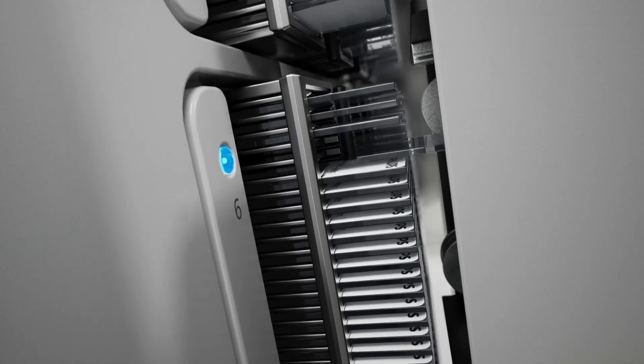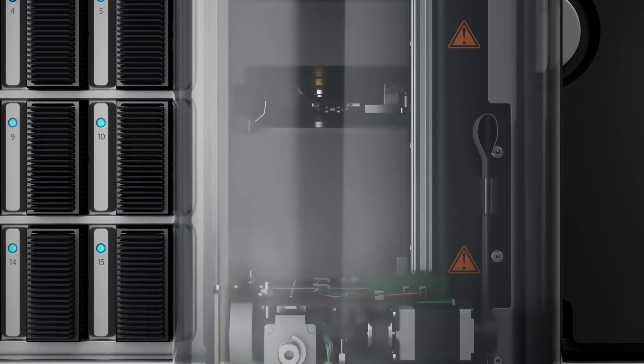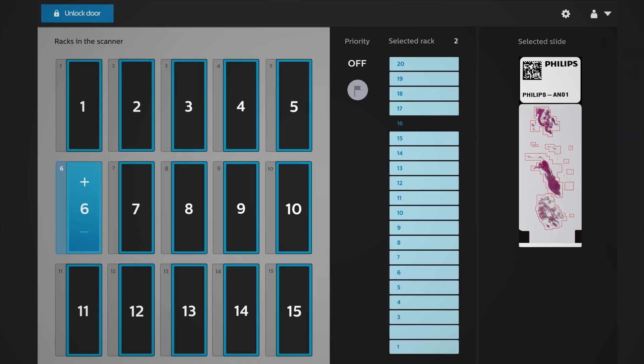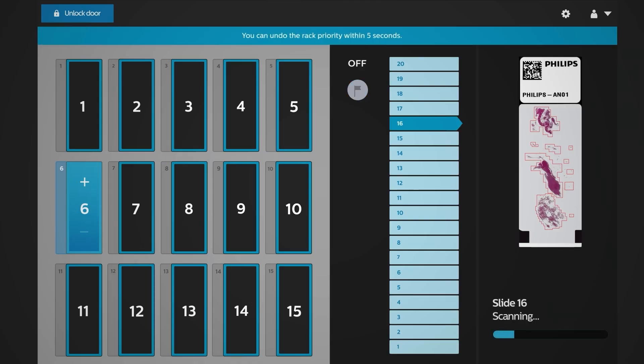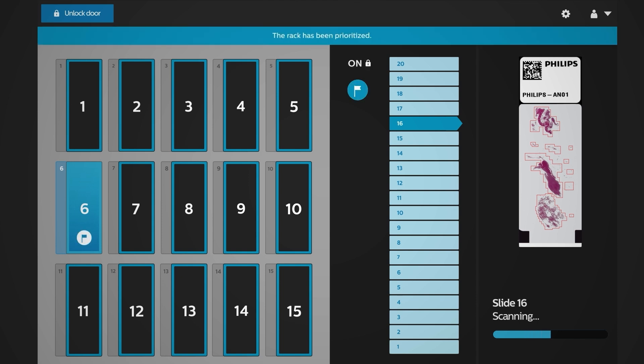While one slide is being scanned, the next one is already picked up and ready to be placed on the stage as the current scan finishes. LEDs signal whether a rack is being scanned, planned, or completed, and you can prioritize the order of the rack without interrupting scanning.